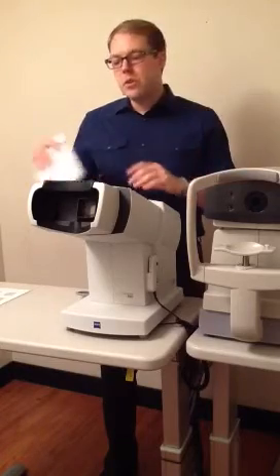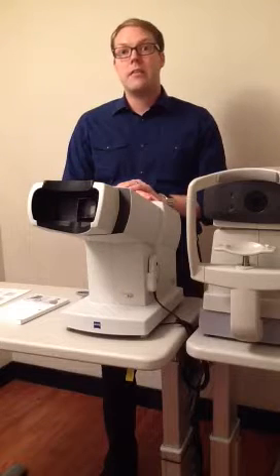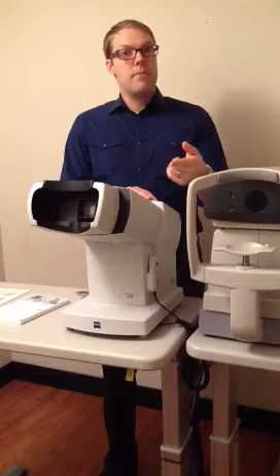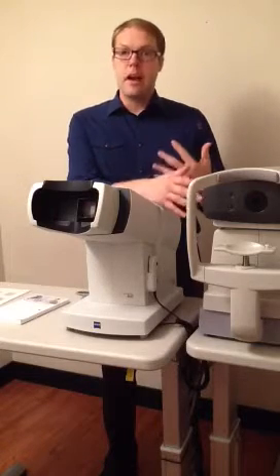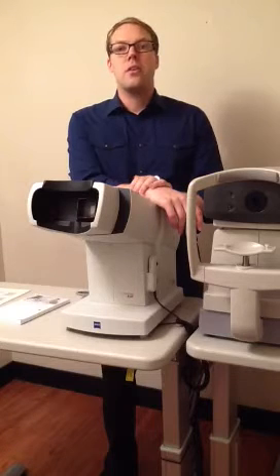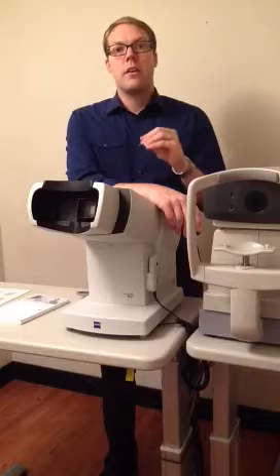So this is the visual field test, and this is a test that Dr. Thompson wants you to have done today. That was the next step. You'll notice that I use the doctor's name, and you'll want to do that too. Your doctor's name carries a lot of weight with your customers because it's not just you making this recommendation, it's the doctor that's making the recommendation, so use their name. And then your customers will take that opinion very, very solidly.